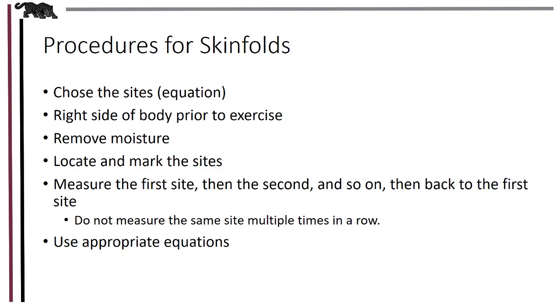First, we always measure on the right side for the simple reason that's how the equations were developed, by the researchers taking measurements on the right side. Skinfolds should always be taken before any kind of exercise for two main reasons. One is to avoid any fluid shifts that can occur, and the other is to keep moisture from accumulating on the skin. So if there is moisture, some people can just sweat standing there, or somebody may have on excessive lotion, make sure you clean it off. This will help keep your pinch caliper from slipping.